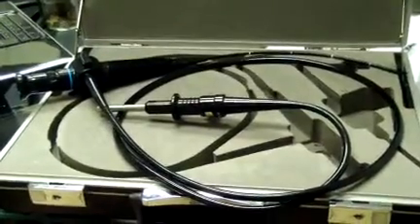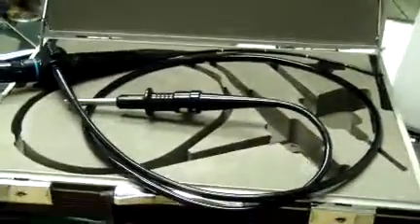Keith from DCSP Medical. Today we're looking at an Olympus ENF P3 Rhino Laryngoscope.